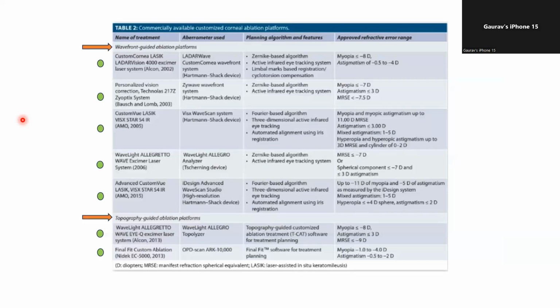So that's why the predictability suffers, and then you're trying to correct maybe internal aberrations on the cornea, which is not a great thing. You're trying to superimpose corrective treatments on the cornea, while the aberrations may exist internally. And as you have seen recently on the eye trace, sometimes the internal aberrations may be crazy. Now we can segregate them between the cornea and the internal optics. At that time, we didn't have the technology to segregate them. Had we known this, we would have separated out those patients who had very bad internal aberrations, because then you were trying to correct it on the cornea, right?